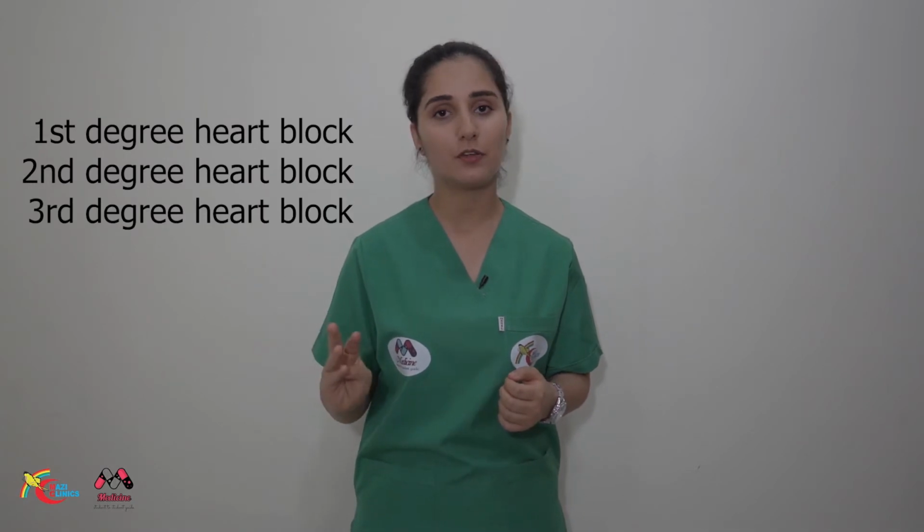Now, in the condition where the PR interval is more than 5 small squares, think about heart blocks. We have 3 types of heart blocks: first degree, second degree, and third degree. In first degree heart block, the only thing that you will see on the ECG is that the PR interval is more than 5 small squares. This means there's a delay at the AV node.